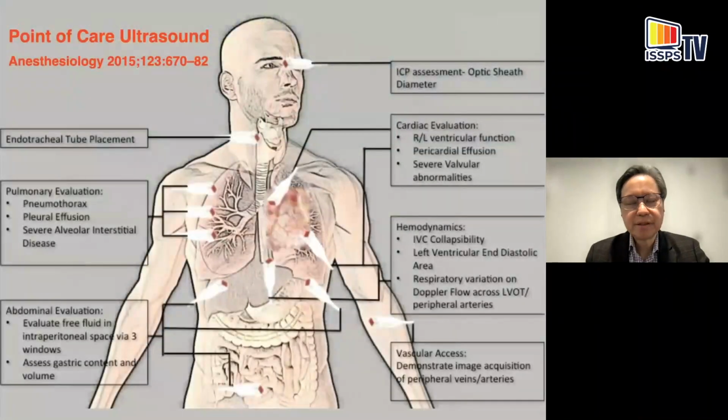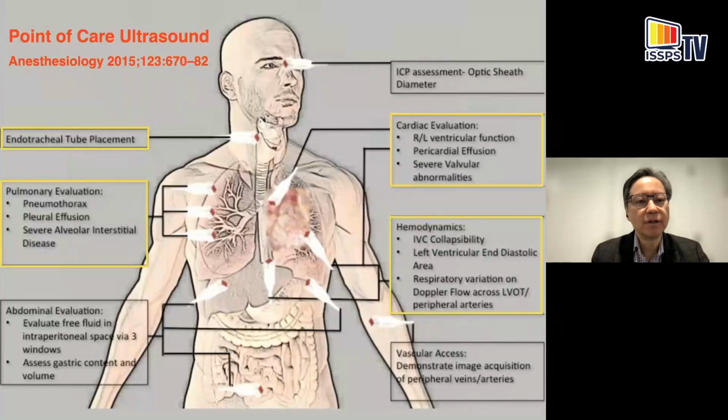In this webinar series, you see how useful point of care ultrasound is to assess the airway, to look at the diaphragm and the lung, to assess the cardiac size and function, the stomach that I'm going to talk about, and finally, the last lecture on the hemodynamic assessment for shock states.